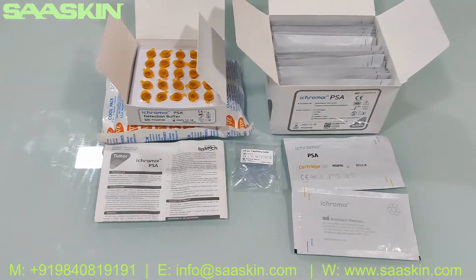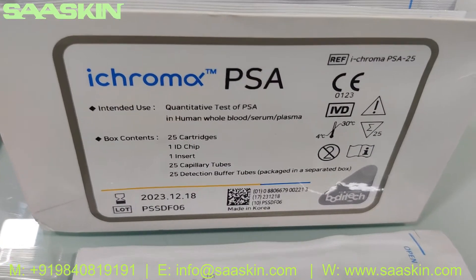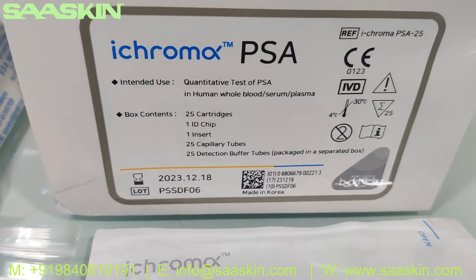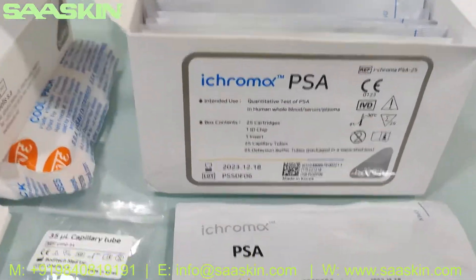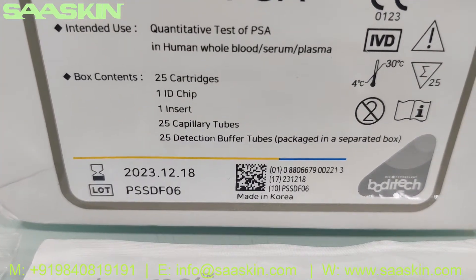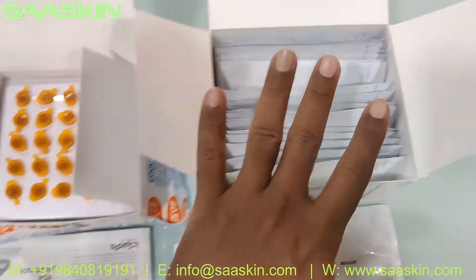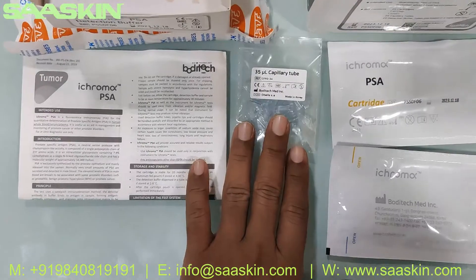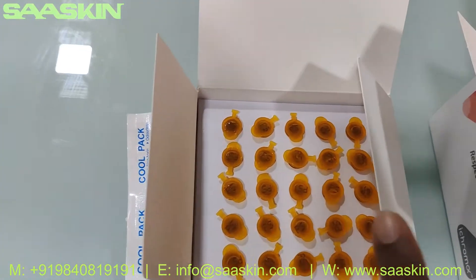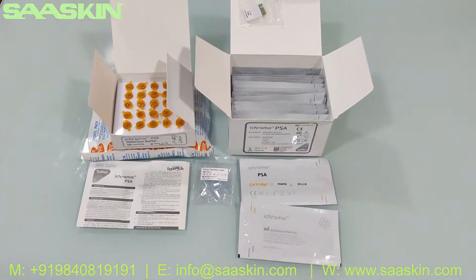Okay, to quickly summarize — this is the unboxing of the ichroma PSA Prostate Specific Antigen test kit, used with human whole blood, serum, and plasma. Inside each kit you get 25 cartridges, one ID chip, one insert, 25 capillary tubes, and 25 detection buffer tubes. This is the whole box, the insert, 25 capillary tubes, 25 cartridges, one ID chip, and 25 buffer bottles — this is how the total test kit looks.